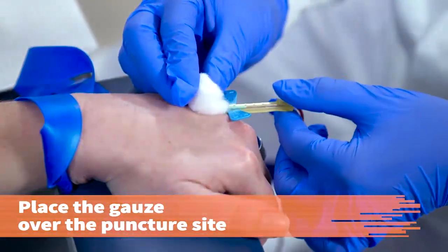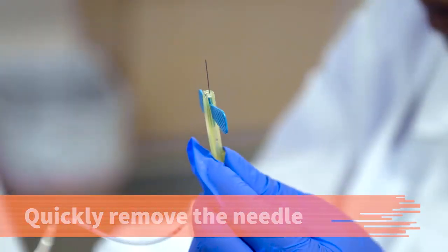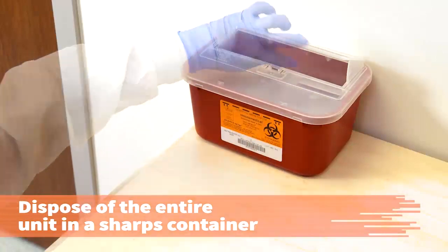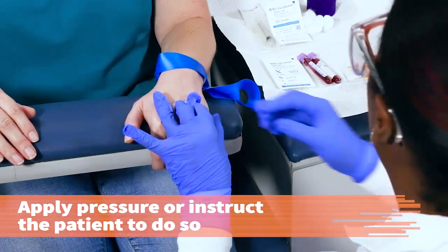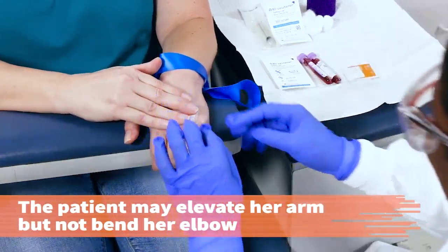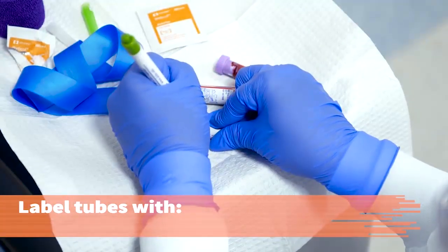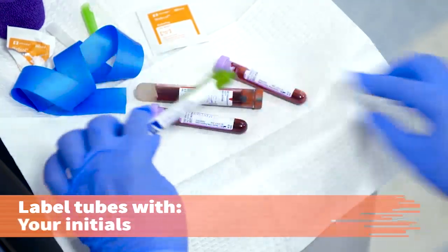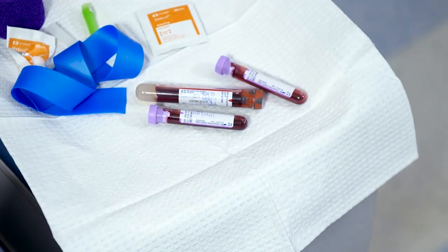Place a gauze pad or cotton ball over the puncture site and gently remove the needle, engaging the safety device. Dispose of the entire unit in the sharps container. Apply pressure to the gauze or instruct the patient to do so. The patient may elevate the arm but should not bend the elbow. While the patient is applying pressure to the site, label the tubes with the patient's name, date and time, and your initials. Or, affix the pre-printed tube labels and print your initials on the label.